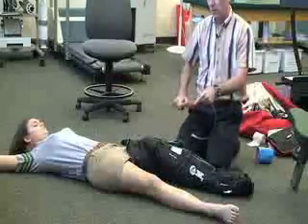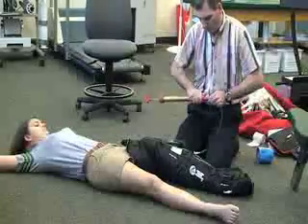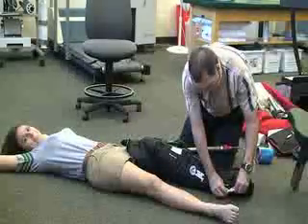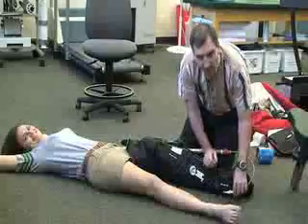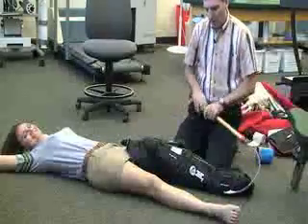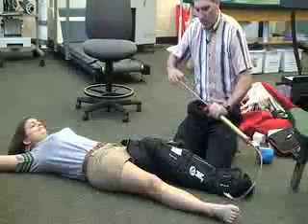To take the air out, you do want to move this down to the bottom. Sometimes you have to force it in a little bit. When you connect this, make sure that you listen for the little snap. Once that's all secure, you're going to suck the air out.